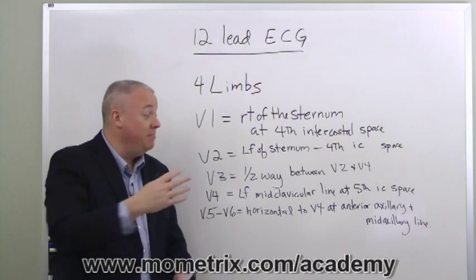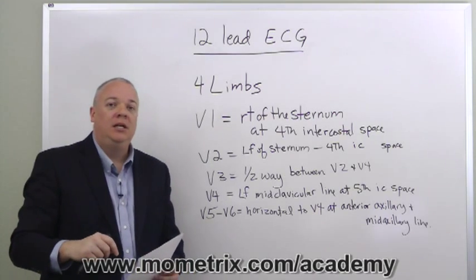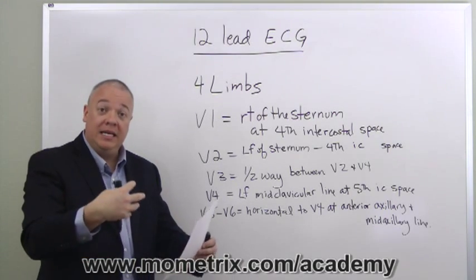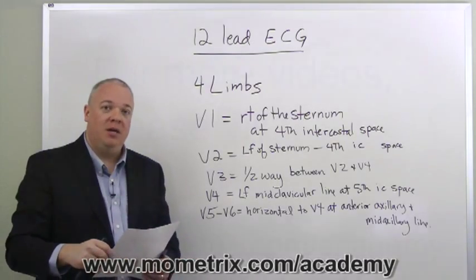Sometimes it's necessary to mirror this setup on the right-hand side to get a more complete picture of what you're trying to determine about the electrical activity of the heart region, for these various reasons already mentioned.